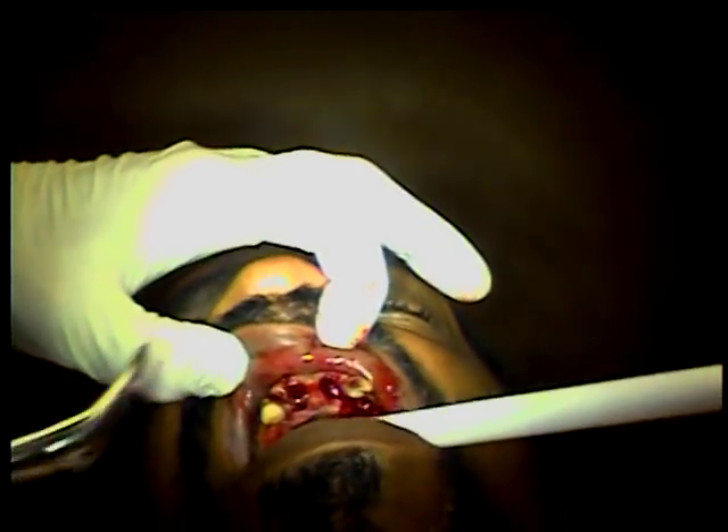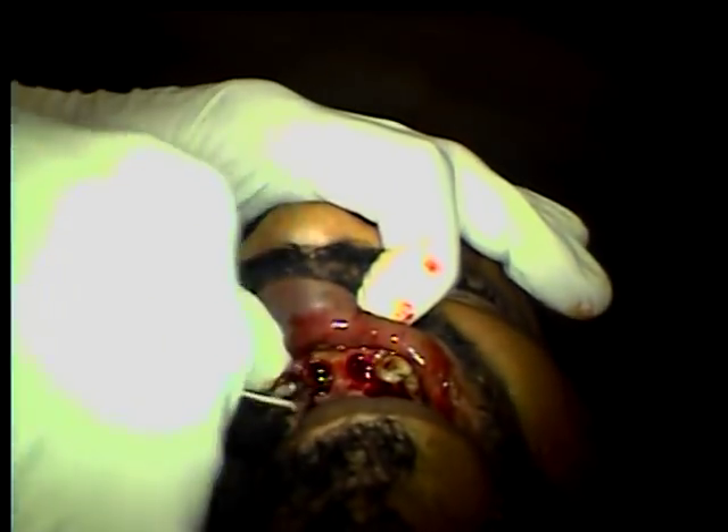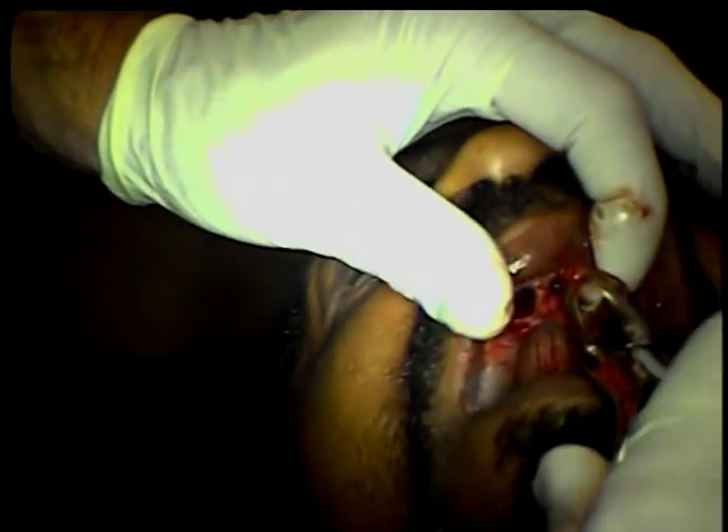Now we're going to come back and get number nine. Open set. It's really important that you understand that these teeth come out mesiodistal — mesiodistal, mesiodistal, they come right out. Popped right out. Mesiodistal, mesiodistal.